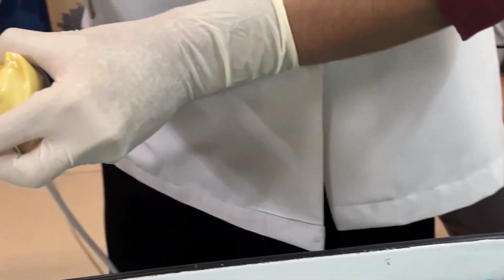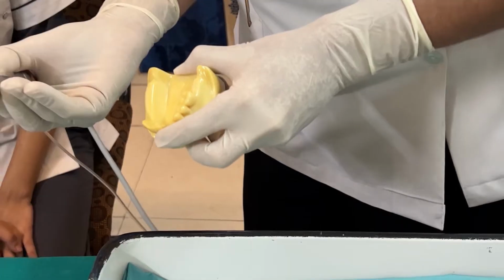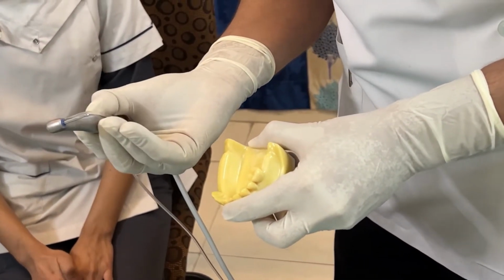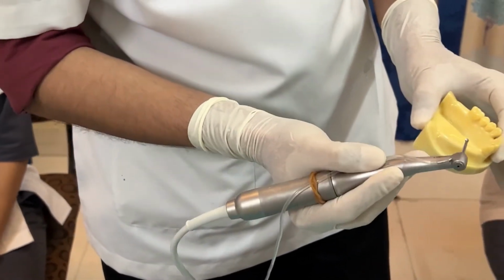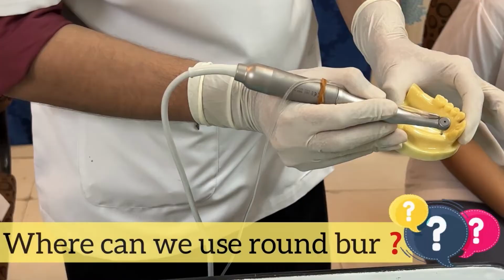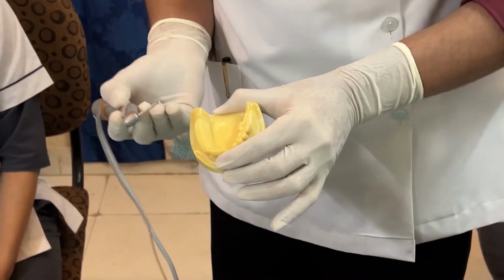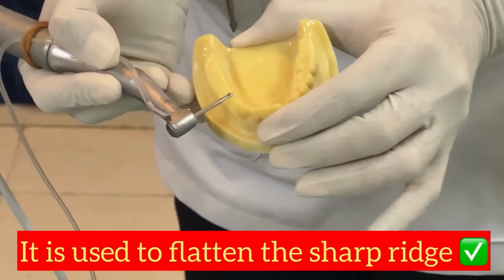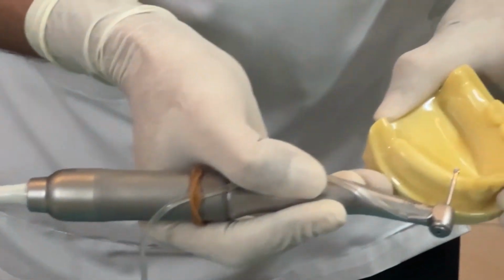Now we always advocate never ever start with the round burr, because this is one instrument which we are not used to using routinely. We are used to using a rotor, high speeds, that doesn't actually slip as such. This tends to slip quite a bit. The main use of the round burr in implantology now is, suppose the ridge is sharp and you want to flatten it out. That is where the round burr is used nowadays.